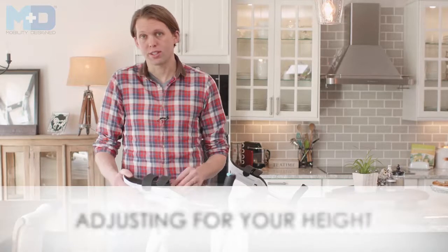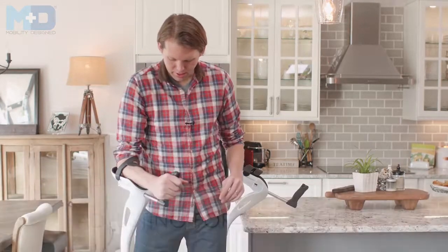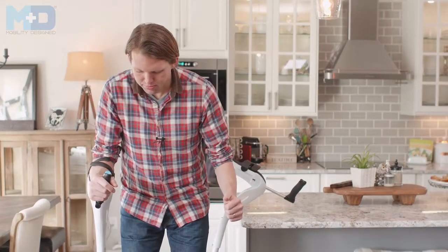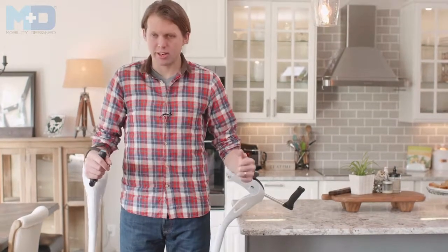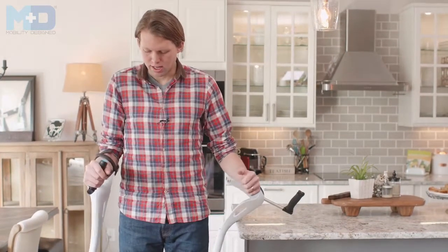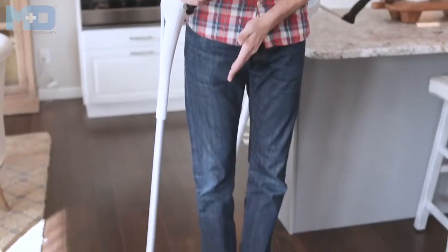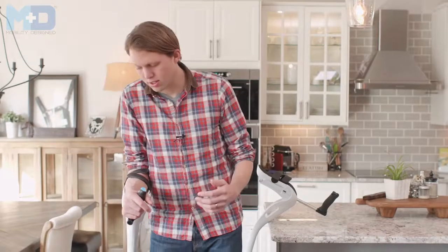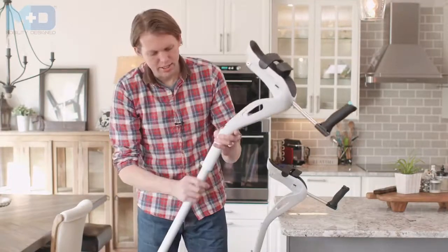To adjust your crutch to the correct height, simply put your arm in the cradle like so. And when you're standing, you want to make sure that you're not slouching over and that you're not having to push your shoulders up. You want to make sure that you're at a natural 90-degree position with your arms tight to your side and your crutch feet slightly out at the floor. Currently, my crutch is a little short. So what we're going to do is adjust the height and raise it up a couple of notches.